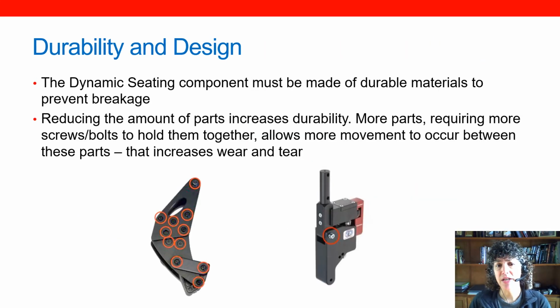The dynamic seating component must be made of durable material or it's going to break. One of the things that also helps increase durability is a number of parts. The more moving parts we have within the dynamic component, the more likely wear and tear or breakage will occur.